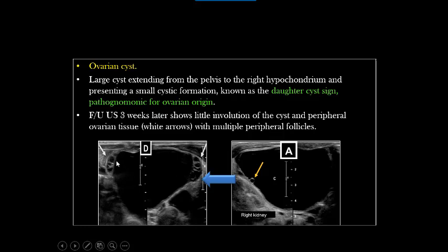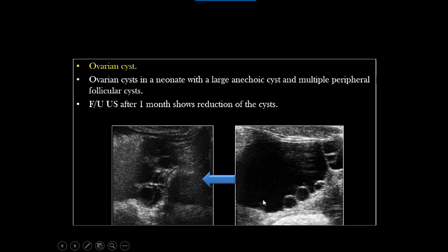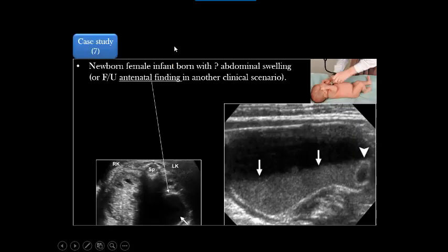This is a simple ovarian cyst. After follow-up at three weeks it starts to reduce in size; the ovarian parenchyma appears containing multiple follicles on each side. It needs follow-up until the third or fourth month. Another case: a large pelvic abdominal cystic lesion found by the clinician, mother, or antenatally. We found a large cyst containing multiple daughter cysts; after four weeks of follow-up it reduced in size and started to disappear. This is a simple ovarian cyst.